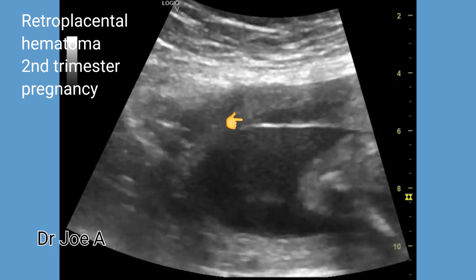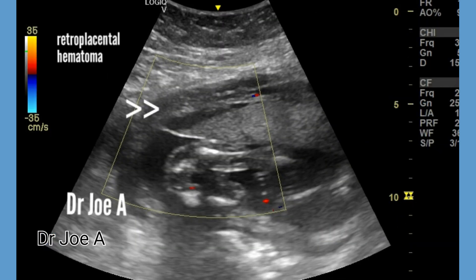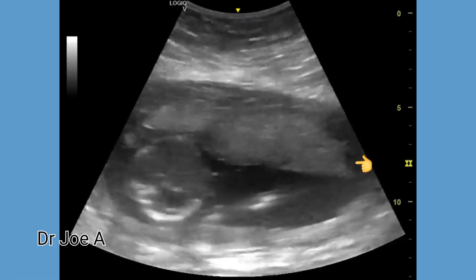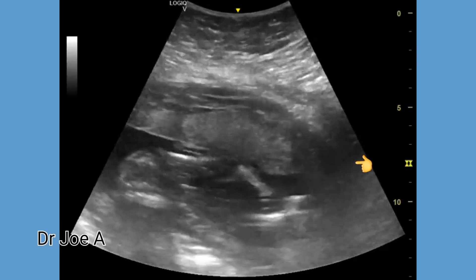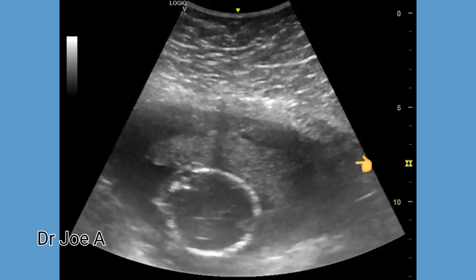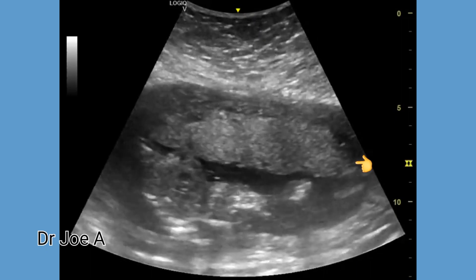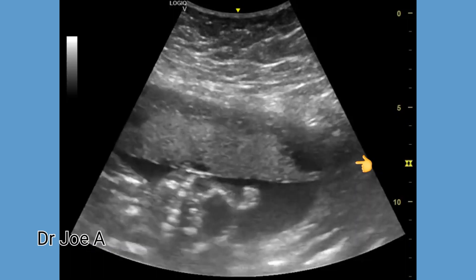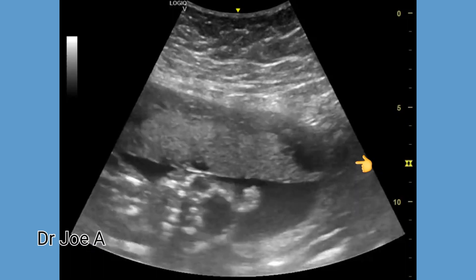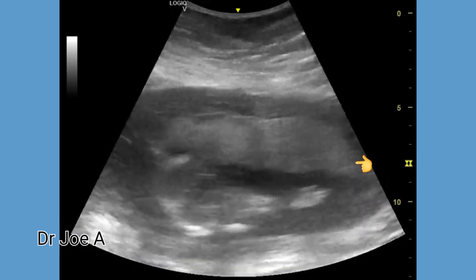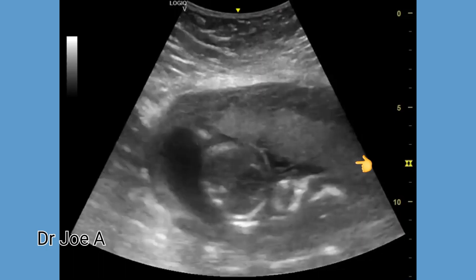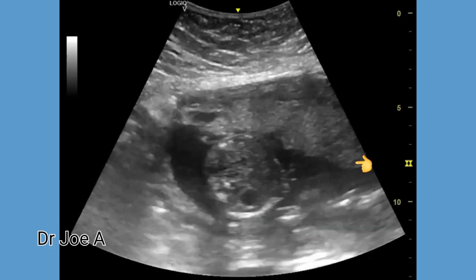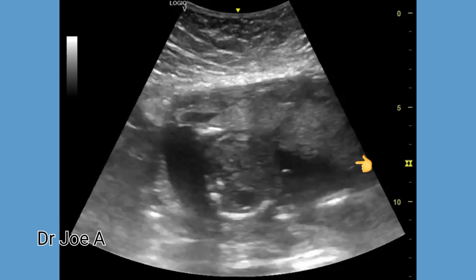Both these retroplacental hematomas are anechoic. Color Doppler shows absence of flow. Retroplacental hematomas can be hypoechoic, anechoic, or even isoechoic. In this patient, both the retroplacental collections appear to lift up the placenta from the uterine walls.